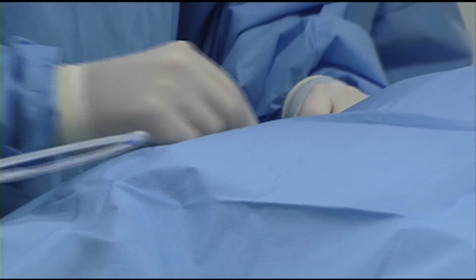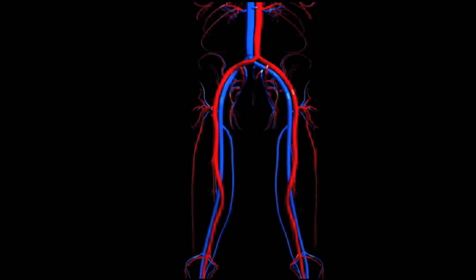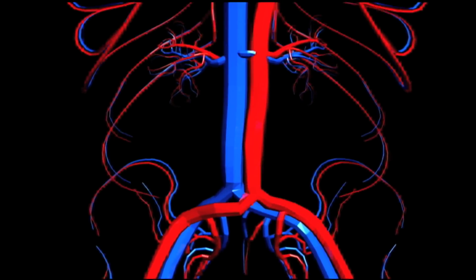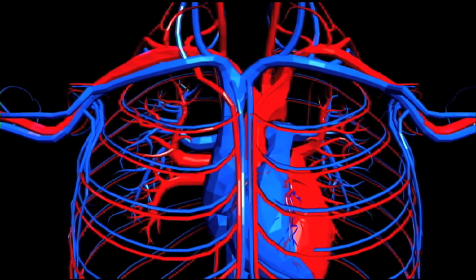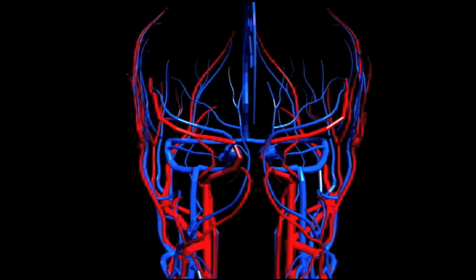One of those techniques is standard angiography, and angiography is basically a technique where you put a catheter into the groin, run that catheter up into the vessels going up to the brain, you inject contrast, and you can actually look at the vessels of the brain itself, and you can look for shift.